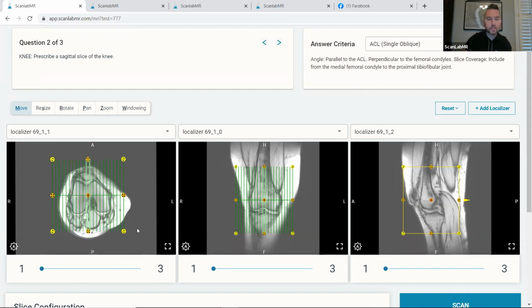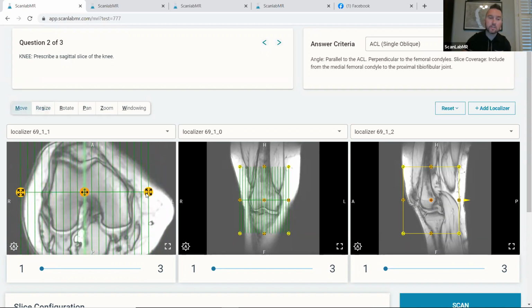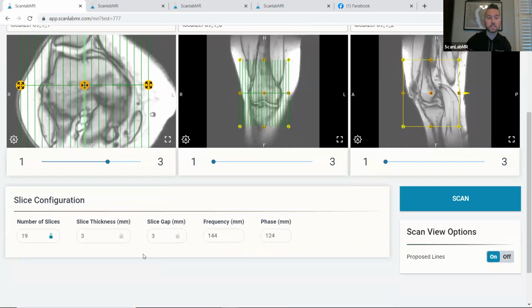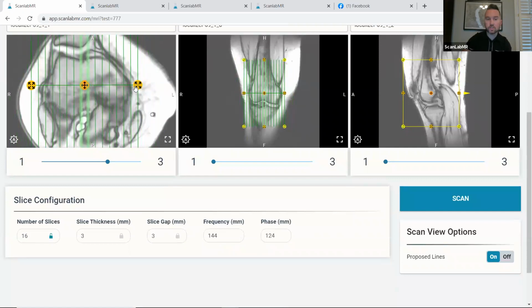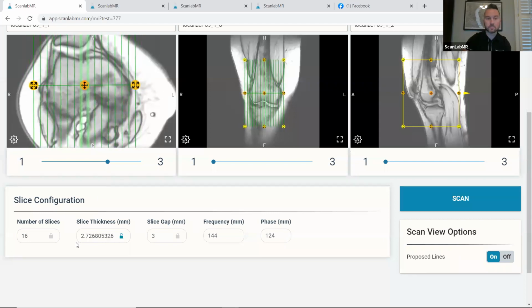You'll see here, if we zoom this up, these dots are responsible for adding more slices, or depending on what you've got down here, something to think about. If I have the number of slices unlocked, when I do this, the number of slices is what changes. If I have slice thickness unlocked, then the slice thickness is what changes. So let me just get rid of my OCD, which is about to lose its mind. Let's get this back to a nice round number for a moment.